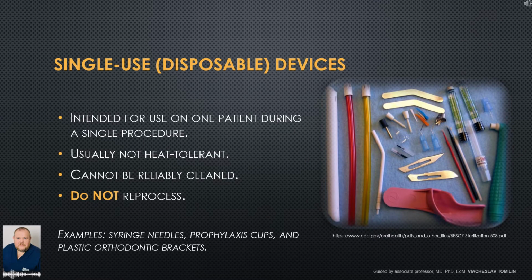Single-use, disposable devices. Intended for use on one patient during a single procedure. Usually not heat-tolerant. Cannot be reliably cleaned. Do not reprocess. Examples: syringe needles, prophylaxis cups, and plastic orthodontic brackets.